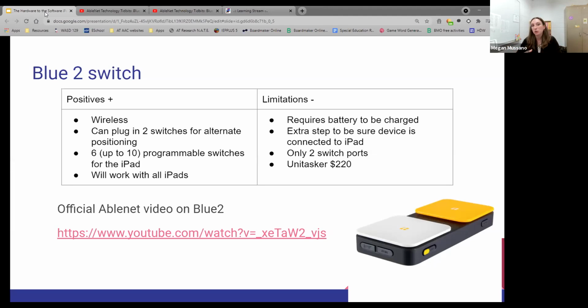As I showed in the video, I had swipe screen left to right and swipe from right to left. So you can assign different functions to the different switches. And that's really how we program the iPad. Now, I know we're kind of touching on the programming as we're talking. Like I said, the next session will go just purely into programming. I'm focusing a little more on the hardware now, so I don't want you to feel like I'm not giving you everything you want.